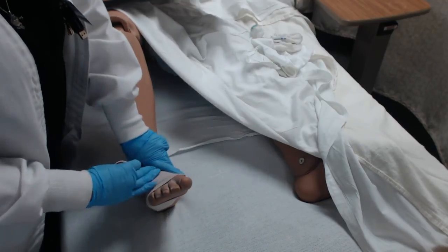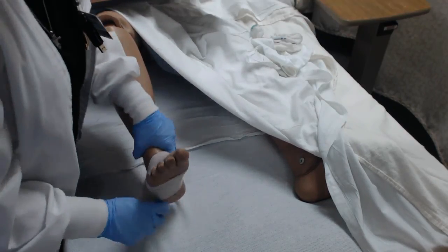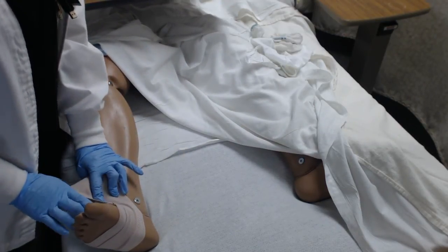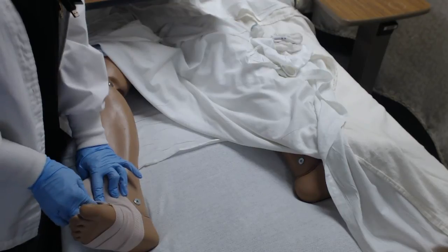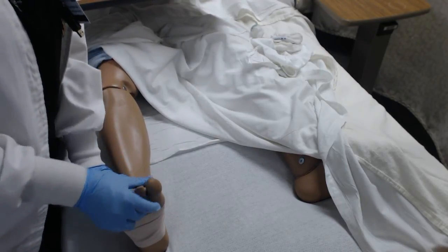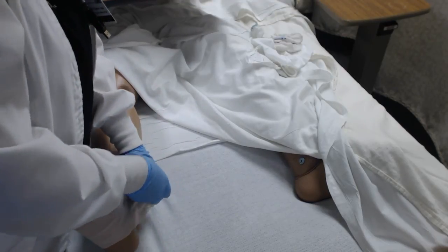So we want to overlap about a half an inch to an inch. We want a fairly good compression, but enough that we can put our finger between the ACE wrap and the patient's extremity. Too much compression, again, can cause problems with the patient's circulation.